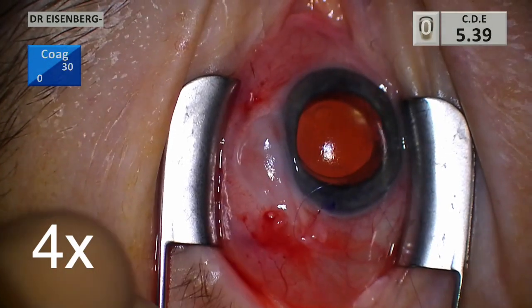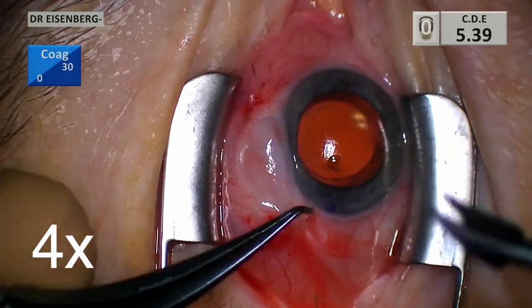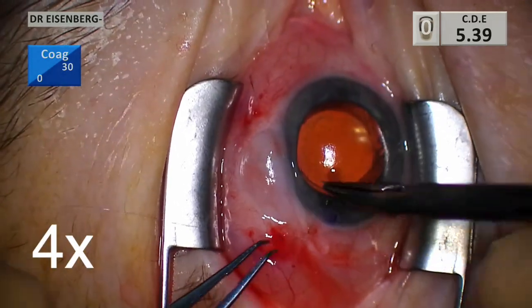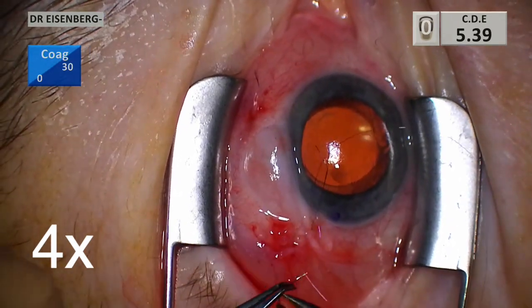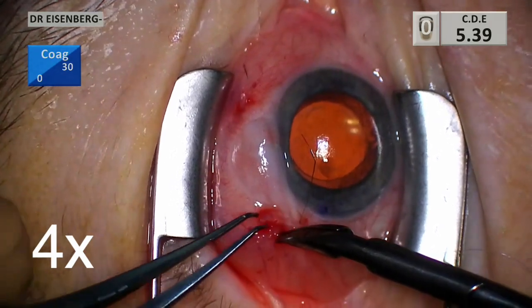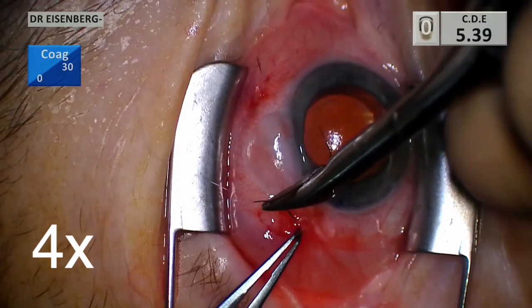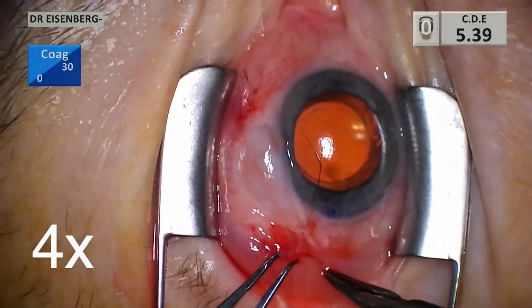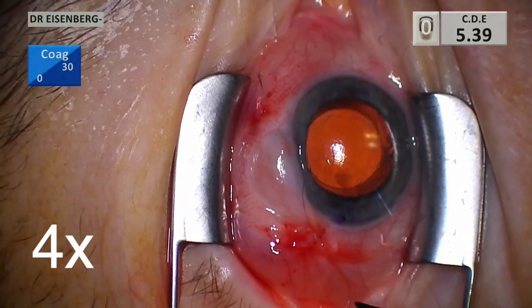Here I'm closing the radial incision with a running horizontal mattress using 9-0 polysorb suture, which is absorbable. This is exactly the same closure I use for my shunts. I'm running through it quickly because there's nothing super interesting about a running horizontal mattress.